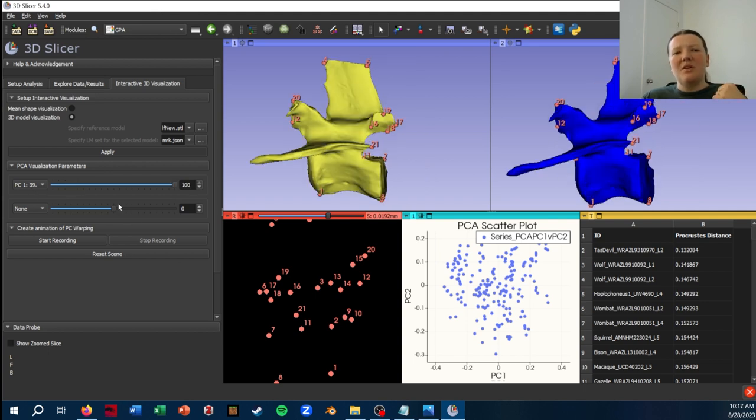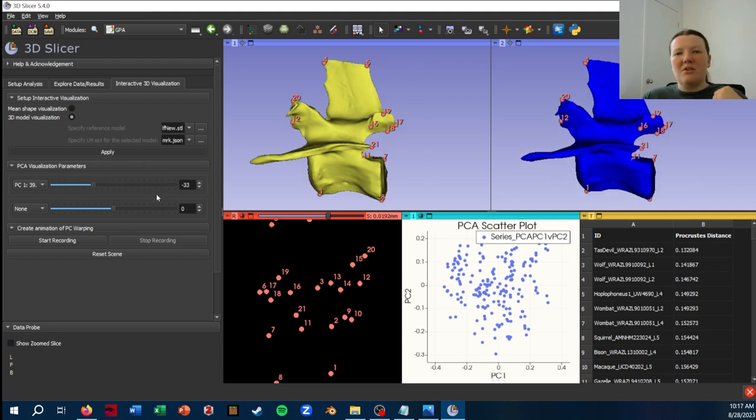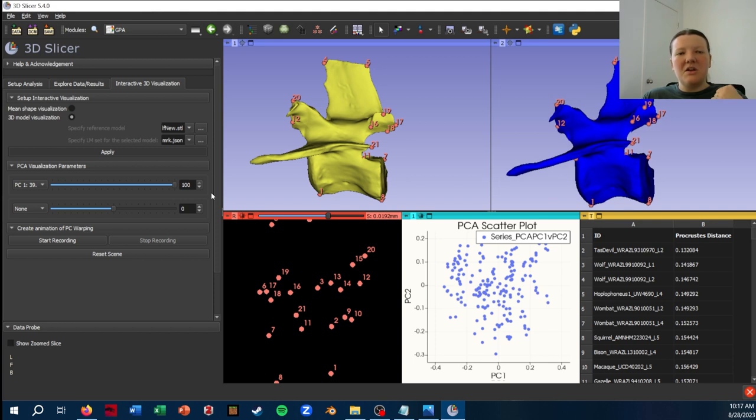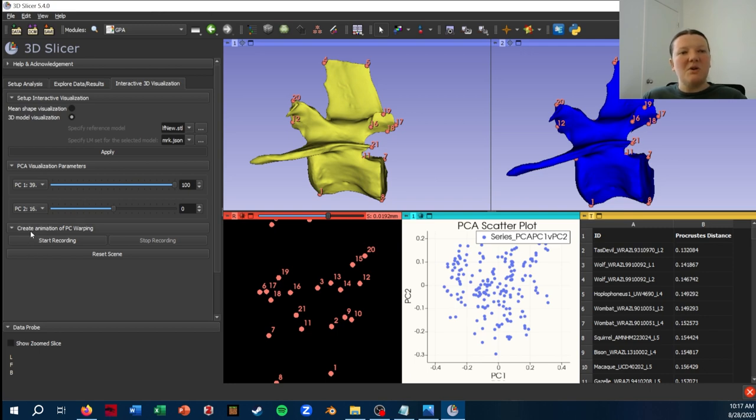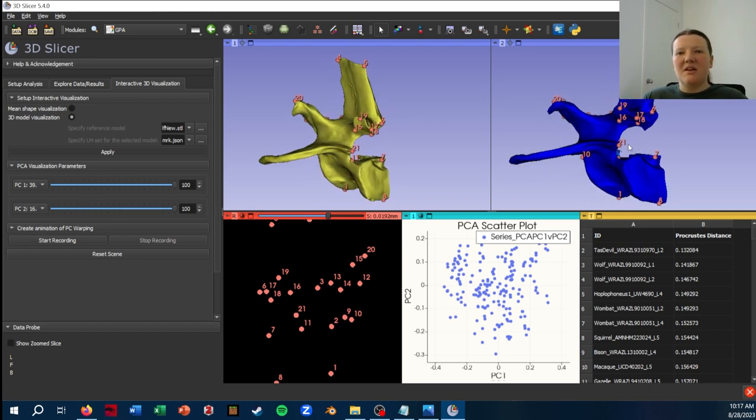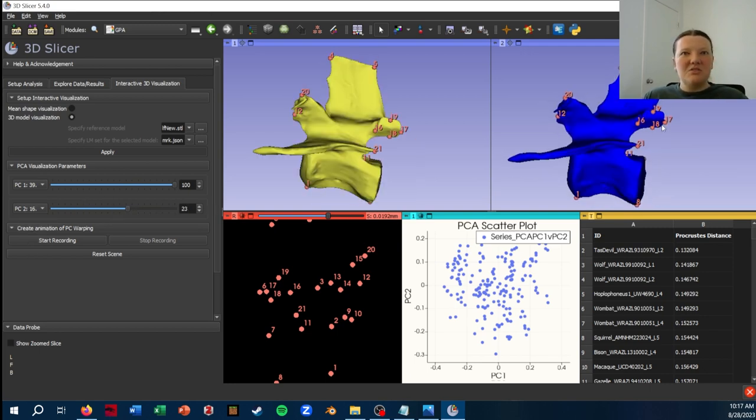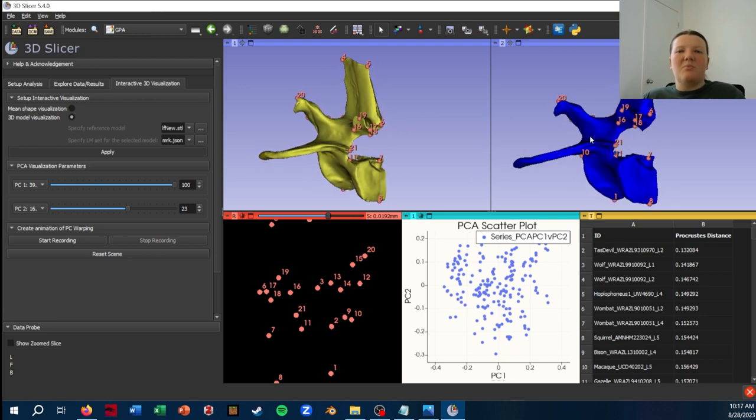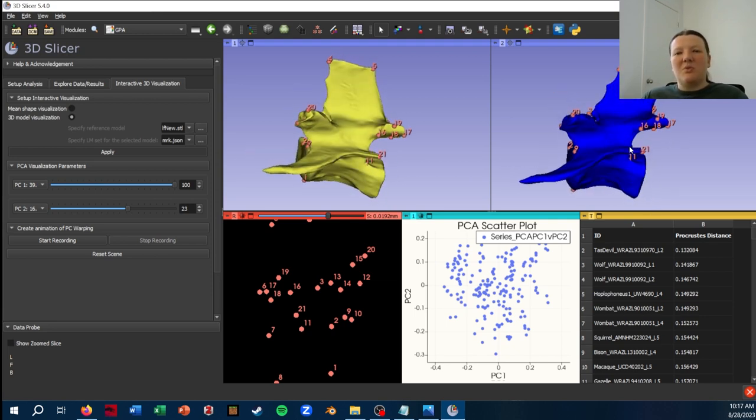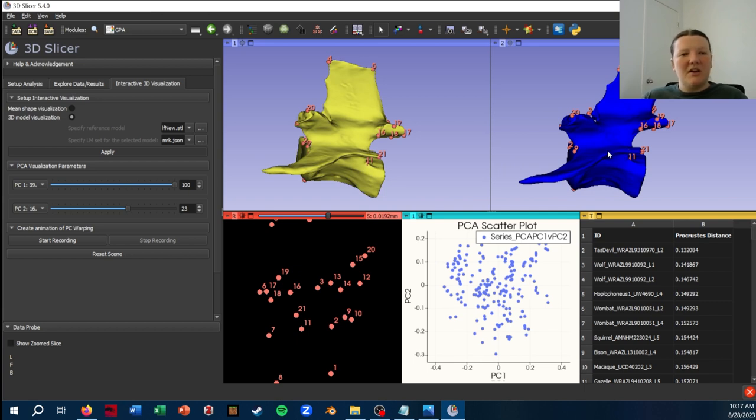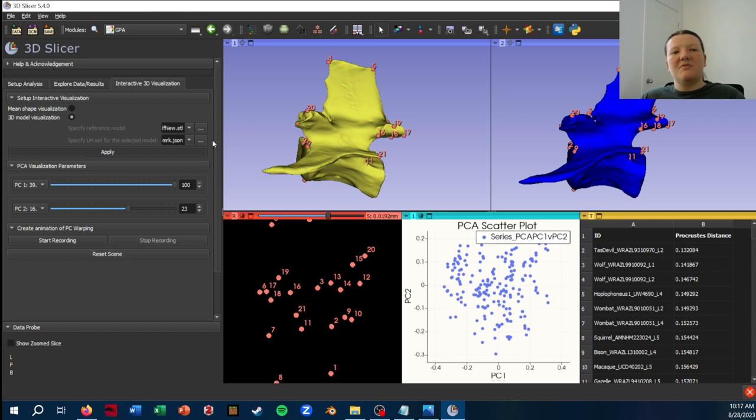So this is a pretty cool feature. You can also combine a look at, let's say, what is the positive end of PC1 plus the positive end of PC2 look like. And this is just a really fun way to play around with your data to really get an intuitive feel for it that I think is hard with the other methods of visualization.